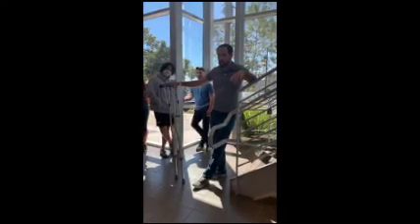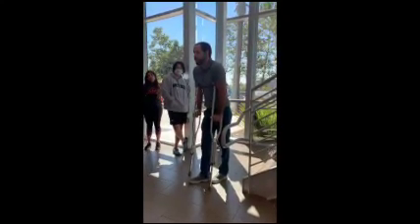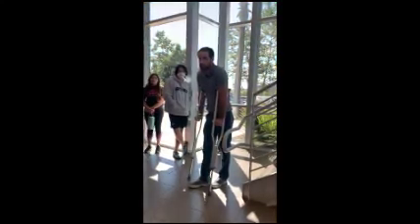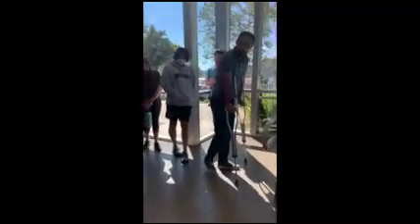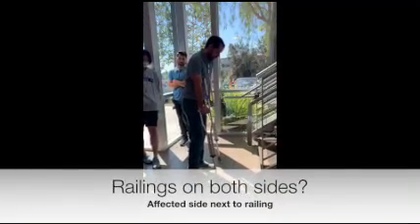My right side's affected. I'm using crutches. Can they reach? Well, even if they could, they need their device probably when they get to the top of the stairs, right? So if I'm right side affected, I have the railing available to me on both sides. How am I going to go up the stairs? My right side is affected. I'm non-weight bearing. So the railing on the right side. So you're using the railing as your second crutch?